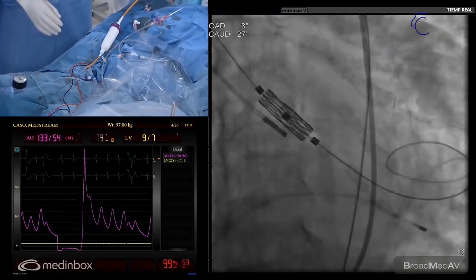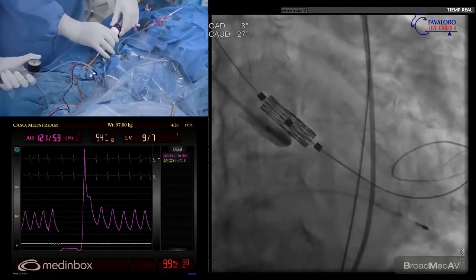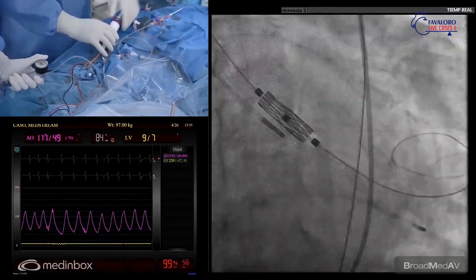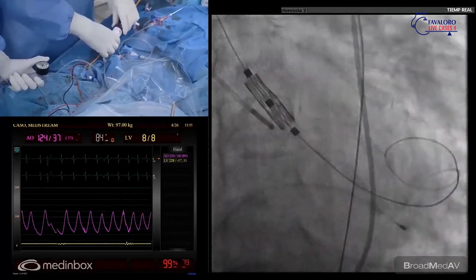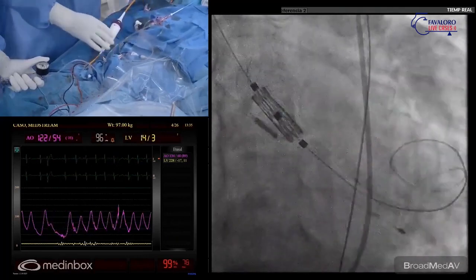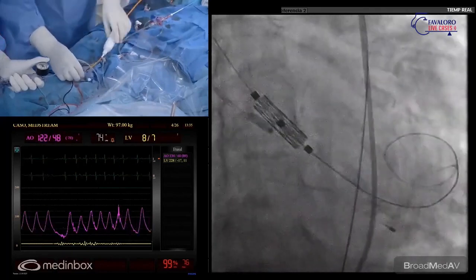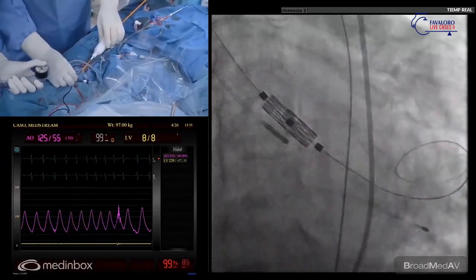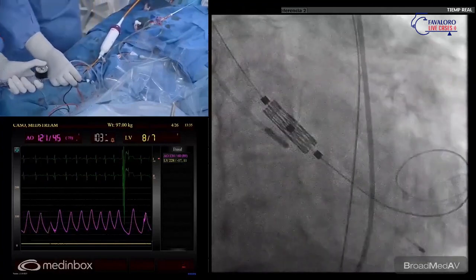So we will have some shortening. Do you have it deflected? Yeah, probably I would take out the deflection, or do you want to keep it? No, I think it's worse. Just to understand how it's going to open. No, I think it's there. Okay, we can pull the wire a little bit. Oh, it goes below. Yeah, because I pulled the wire. Even if you're pushing the wire just to take the valve. Yeah. Good, that's right. I think it's there.